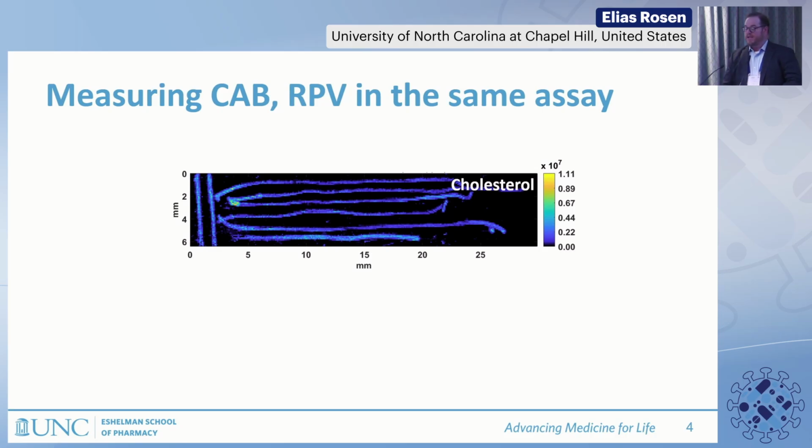Now we've applied this approach to long-acting injectables, and we've developed an assay that's capable of looking at the components of Cabenuva in the same measurement. And typically we evaluate 5 plucked strands from an individual. We prefer plucked strands because that provides us with the most recent growth of hair.